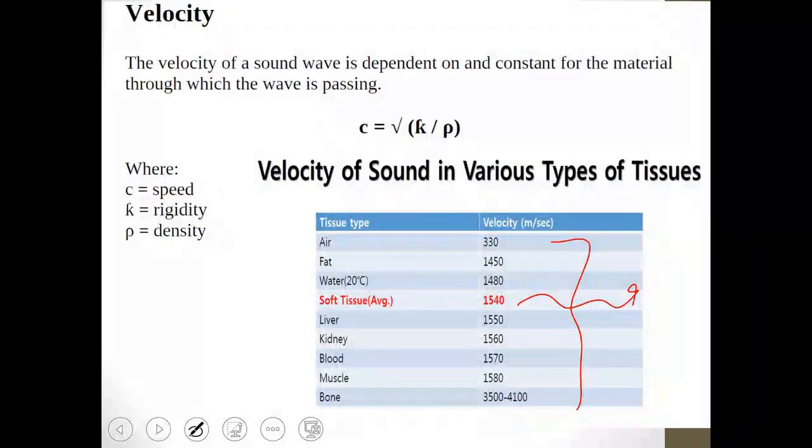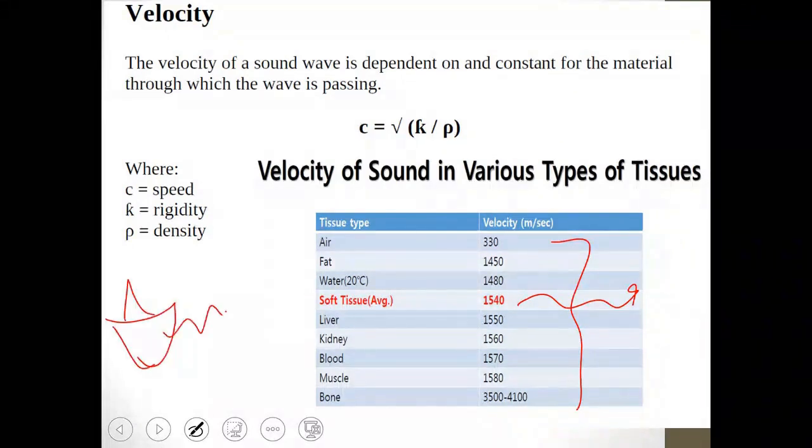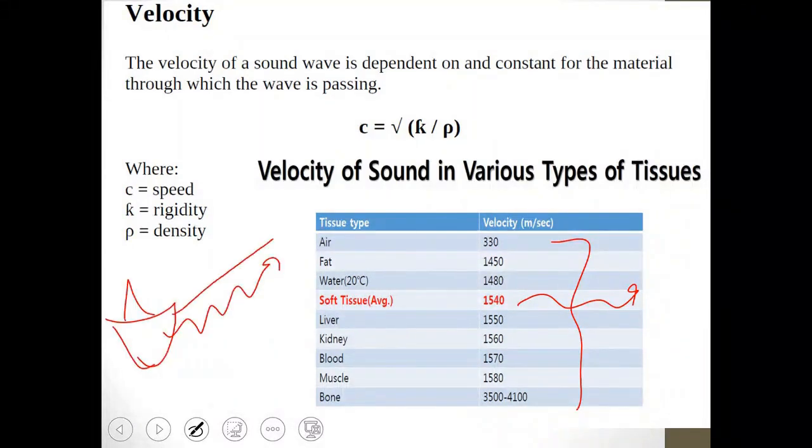Simply put, I want to begin by explaining the initial uses of ultrasound during World War II. They used ultrasound to ascertain the precise locations of their targets in the vast and unpredictable seas. For instance, a particular type of submarine would send out ultrasound waves. Let's say, hypothetically, I have a ship.